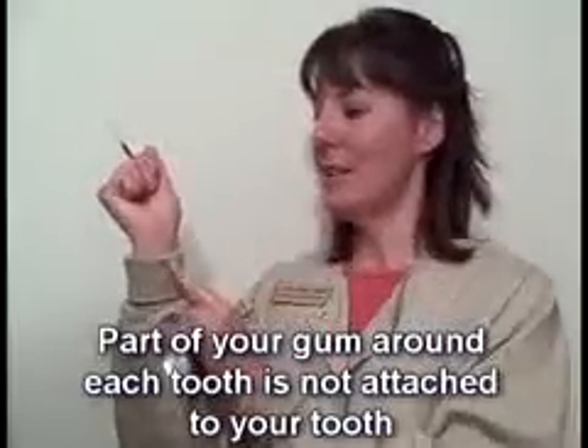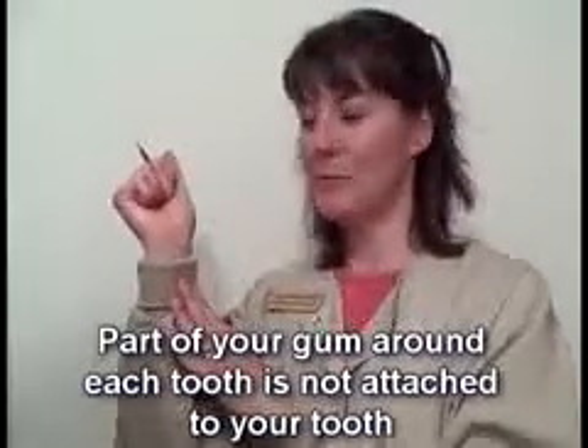I'm going to show you with my hand how it works in your mouth. So let's just say that my hand here is a tooth, this is the root of the tooth, and the sleeve here is gums. Around every tooth, you have an area where your gums just kind of lean up against your teeth, just like this cuff leans against my wrist.